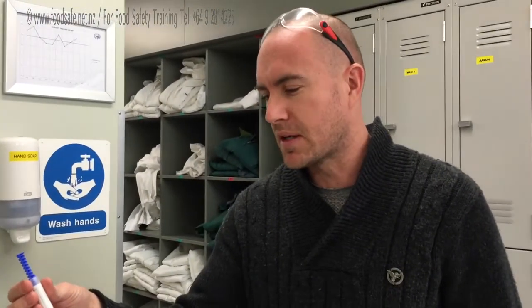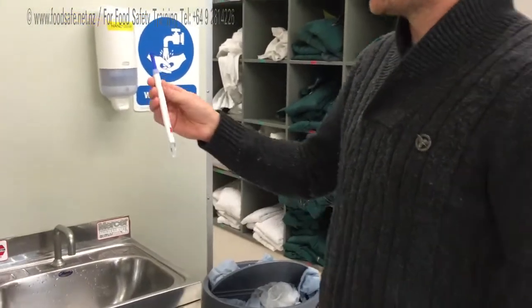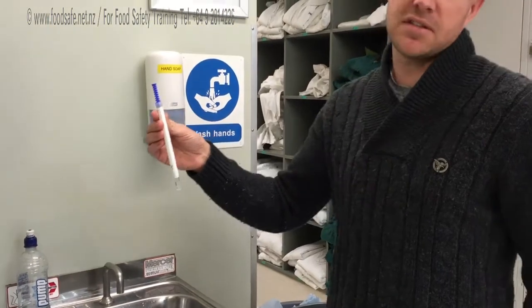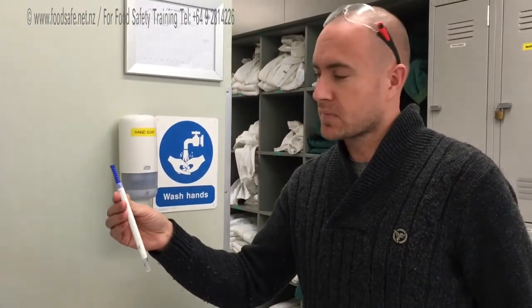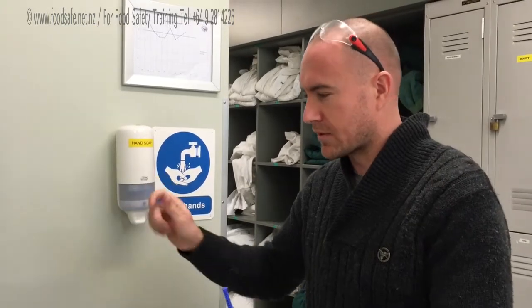First, they have to be kept pretty cold, so we want to keep them at about refrigerated temperature, probably 4 degrees. Basically what we want to do is a 10cm x 10cm area and just smear it on by sort of rolling it around.